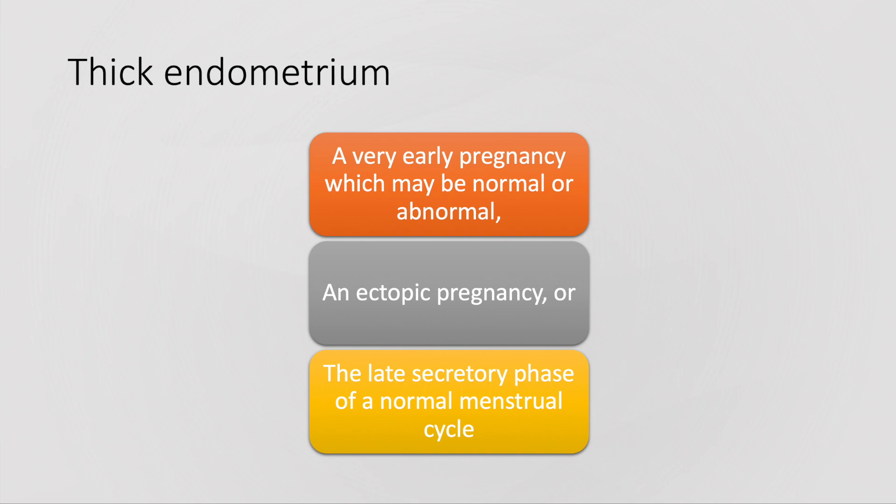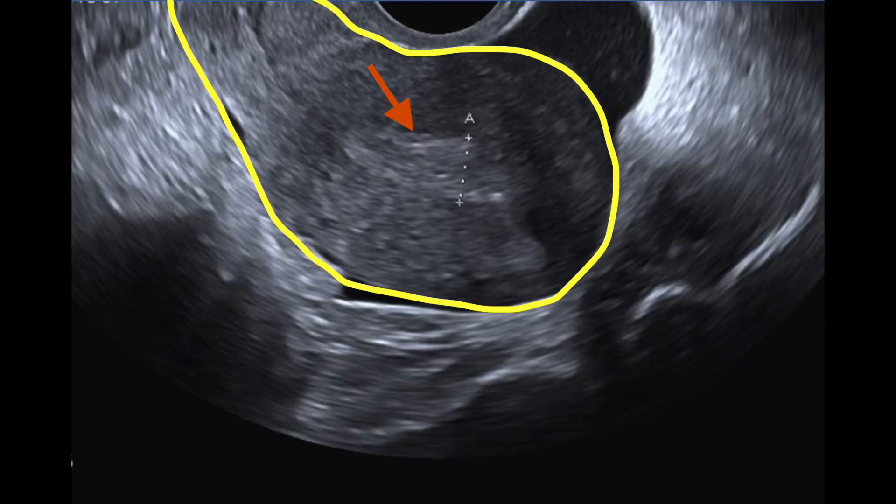A thick endometrium is an early sign of an ectopic pregnancy, which otherwise could also be found in a normal pregnancy and in the secretory phase of a menstrual cycle.